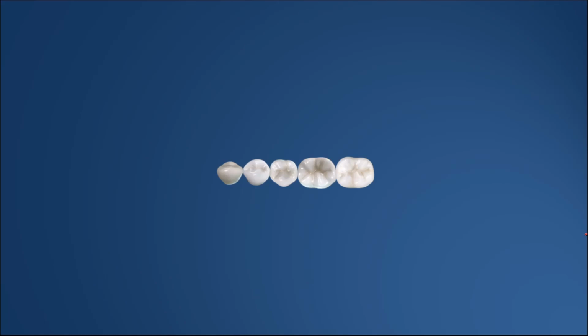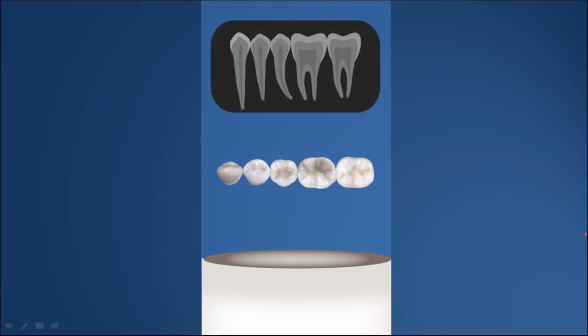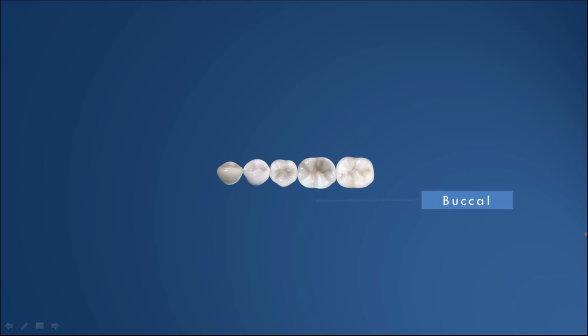Let's consider these as teeth in the mandibular jaw from canine to second molar region, and we are going to make a radiograph. We will focus the X-ray cone straight from the buccal aspect and we can get a high quality radiograph. At the same time, let's introduce two objects to the same radiograph. We are placing an object which is triangular in shape in the buccal aspect and an object which is square in shape in the lingual aspect of the teeth.